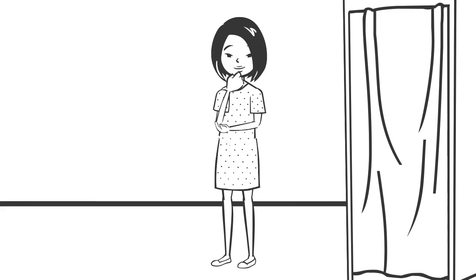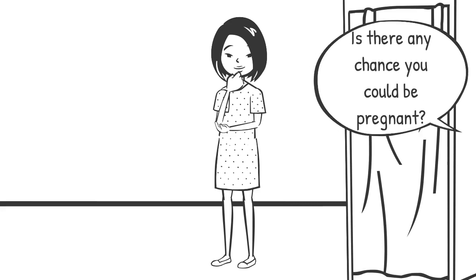clothing contains metal, such as zips, buttons and underwire bras, as these also are not suitable to go into the MRI room. MRI scans can be carried out on individuals that are pregnant, but it is very important to inform the radiographer at your appointment if you know or suspect that you might be pregnant. This is because more safety precautions must be taken. It is not recommended to have MRI contrast agent injections if you are pregnant, so please let the radiographer know if you might be pregnant.